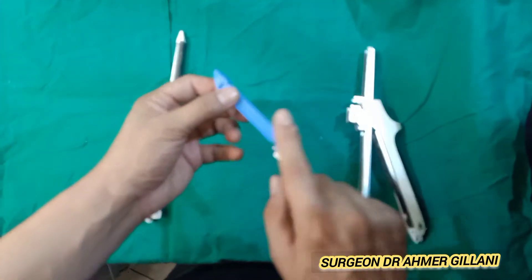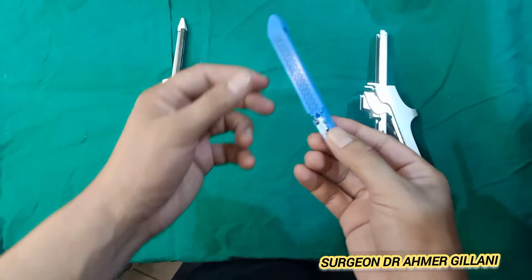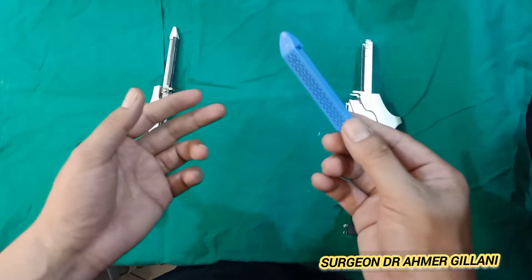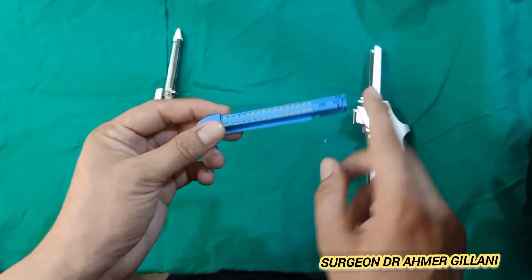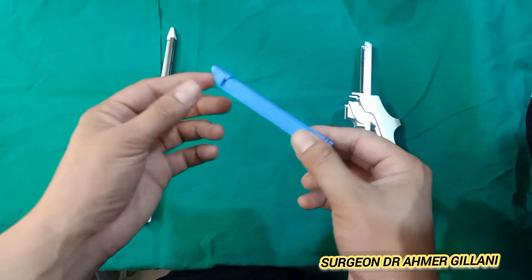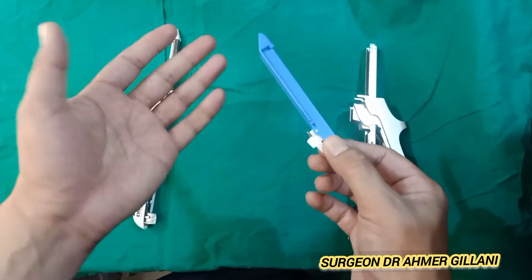This blue part is known as a cartridge. It comes in three colors: blue, green, and white. Blue is used in the intestine. Green, as its thickness is more and the depth of the pin will be more, is used in the stomach. White is used in the vascular system.